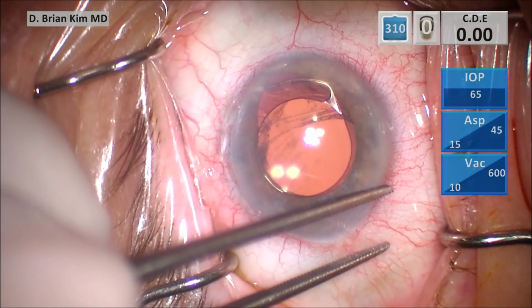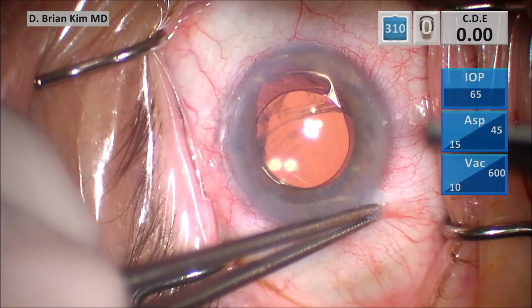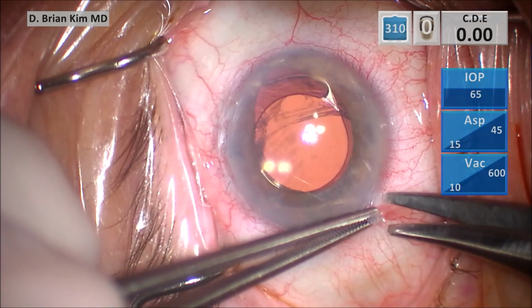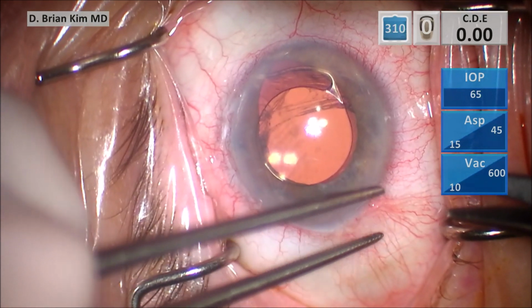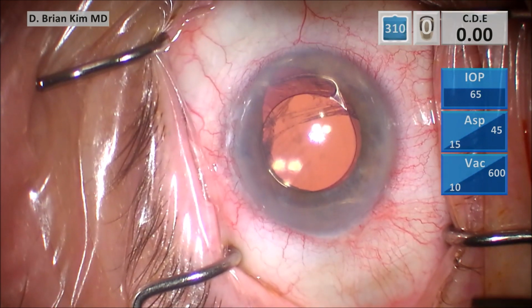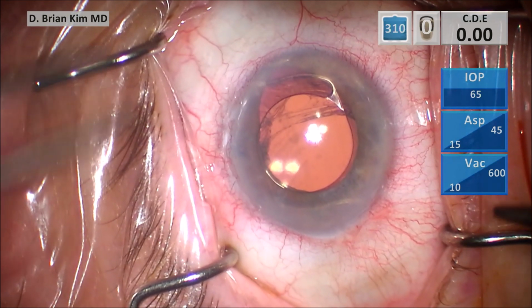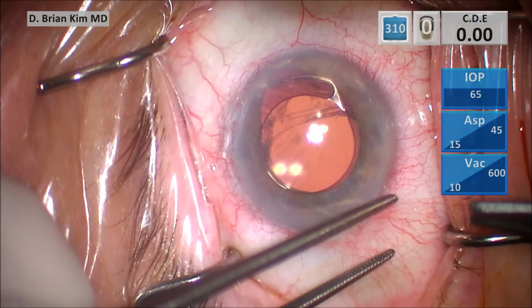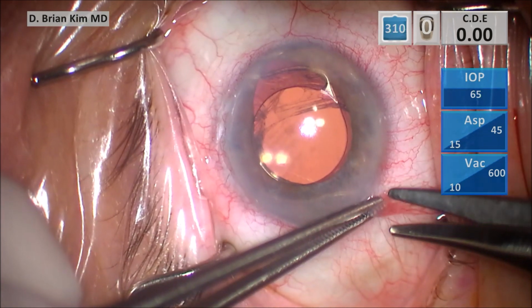And because of that large incision, the patient had over 6 diopters of astigmatism. So I spoke to the referring doctor and said, my plan of attack is this: they had a very large superior incision. You can probably see on the left side of the screen that this patient has some sutures there already, through a superior incision. And so I'm going to make a temporal incision, a large incision, to counteract the astigmatism, hopefully, and also take out that anterior chamber lens and perform a Yamane technique as well as a pupilloplasty. So that is my plan of action.